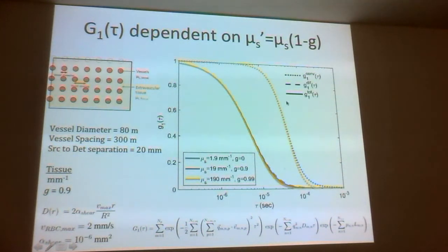No, in your diffusion model, you have a diffusivity in there as well. And I'm just wondering, you use an essentially one-dimensional approach, but what if there is anisotropy? If you introduce anisotropy, then you end up with a tensorial approach to your diffusion, and that might be a simpler way of explaining this.